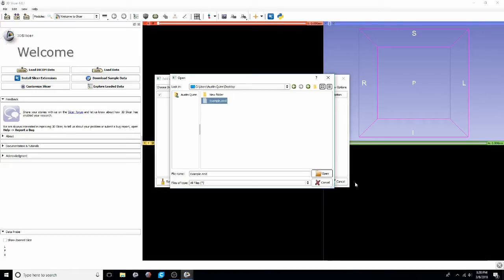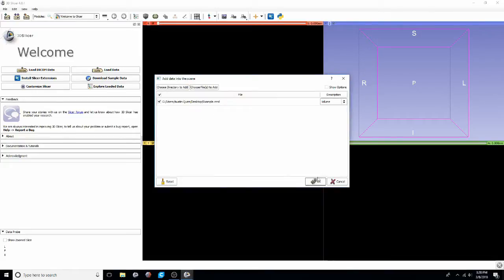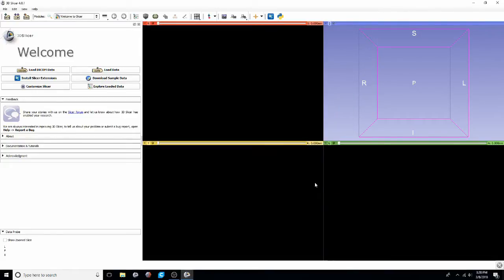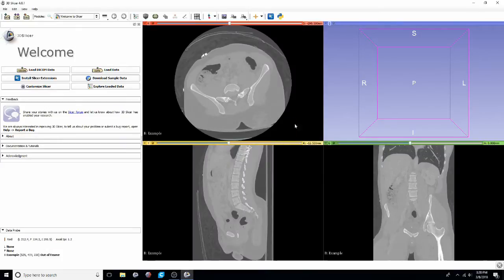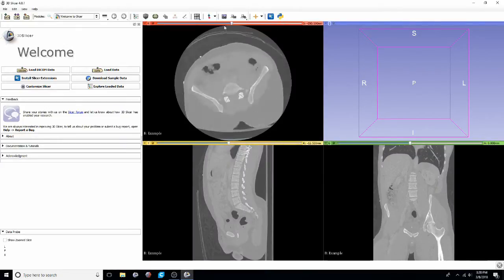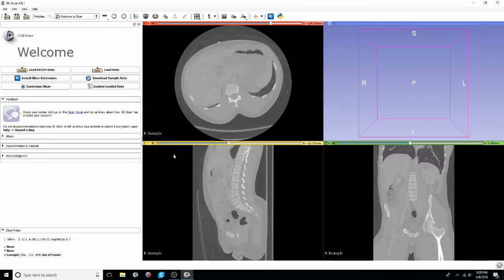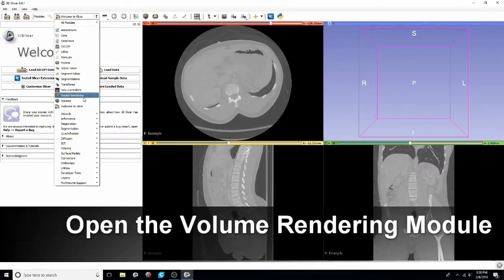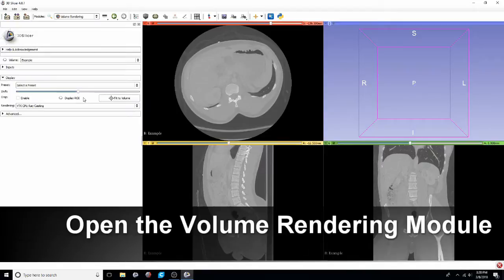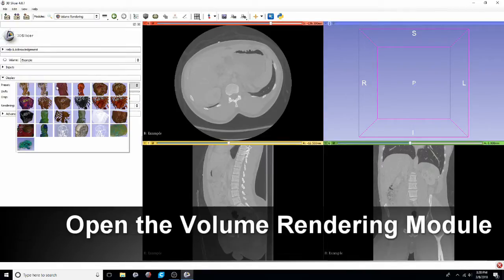Once we have it loaded you'll see that we're in the standard 4-up view which is the three traditional radiology views as well as that blue box which shows the 3D model. In order to see it though we'll have to go to the volume rendering module. Select any one of the presets. I like CT bone.